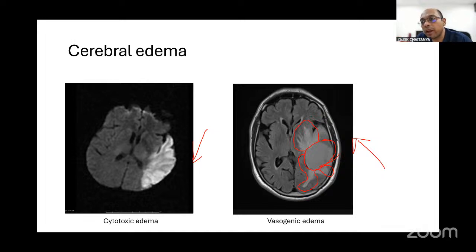MRIs also help in identifying pathological lesions, especially in patients presenting with seizures or status epilepticus, and whether a lesionectomy can help in their management. So a basic understanding of MRI, how images are acquired, what pathology is happening in the brain parenchyma, and how it shows in the images, helps in choosing what to use: thrombolysis or intervention, hyperosmolar therapy, anti-inflammatory therapy, or, if it is predominantly interstitial, CSF drainage.